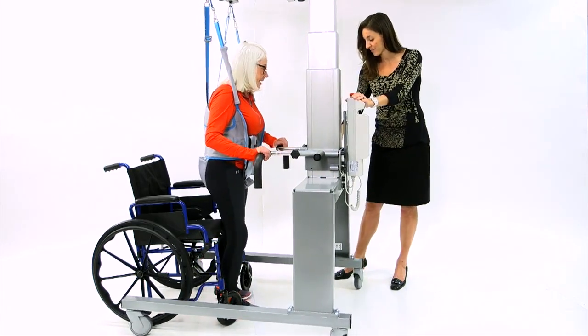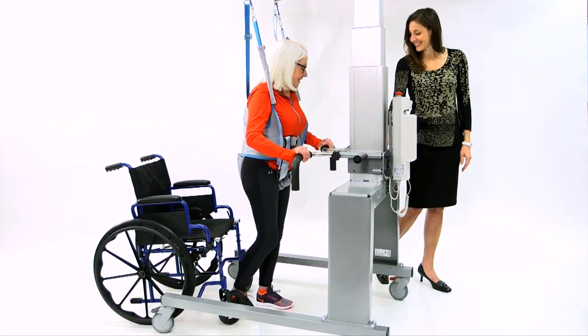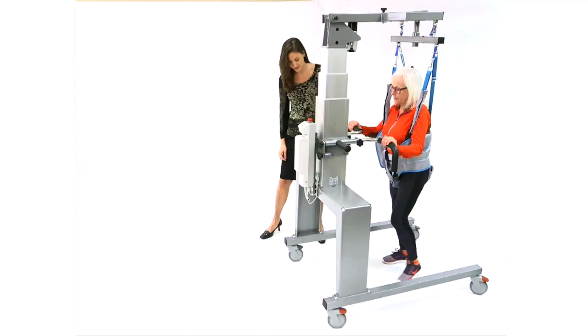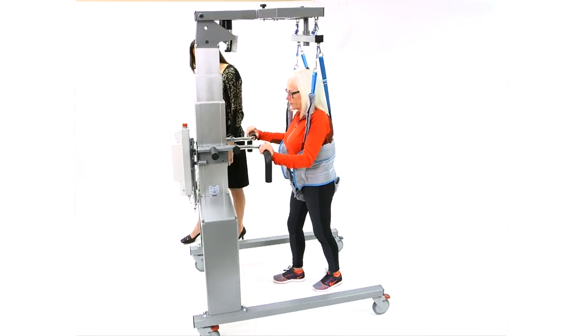Featuring a 28-inch powered yoke adjustment, the Physiogate is ideal for quickly and easily lifting patients from sitting in a wheelchair to a standing position over a treadmill.